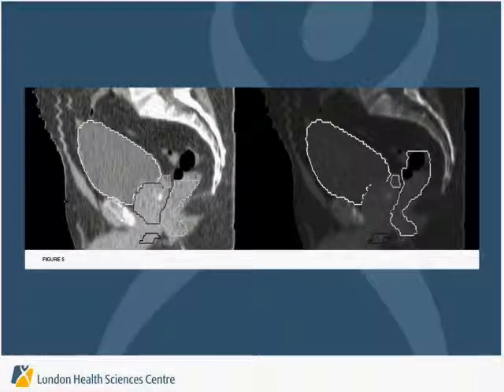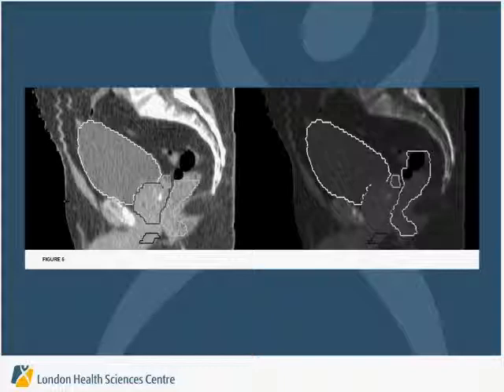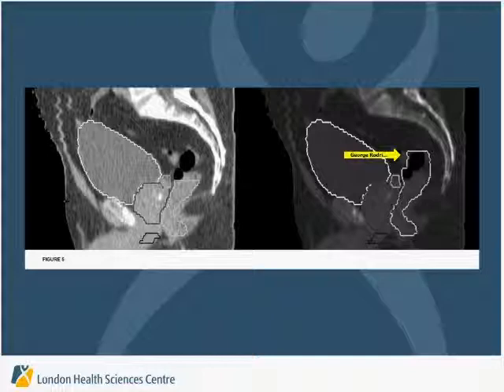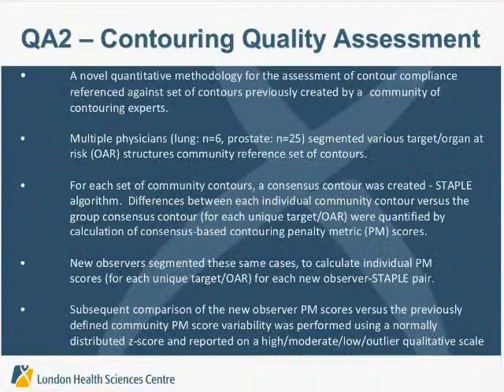Another clinical example from one of the cases was in the prostate. One of the residents under-contoured the rectum, and this system was able to pick it up. After the teaching intervention, he re-contoured the rectum, and you can see that there was rectification compared to the expert contourer.